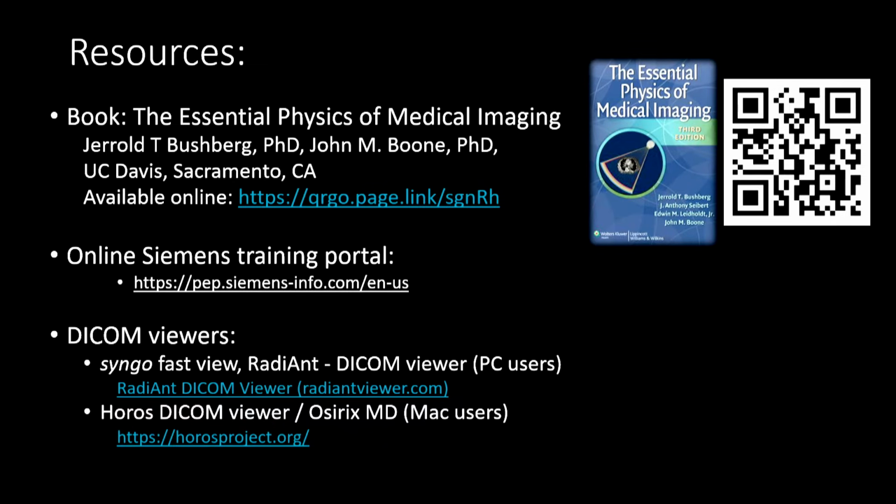And for some online training, depending on what system you have access to, there are some online training resources from Siemens. In terms of DICOM viewers, this is often the question I get from fellows. Okay, I only have access to images in PACS, but when I am doing a case tomorrow, I want to be able to at least look at these images quickly before I come in and scrub in on these cases. What are the tools I could use?